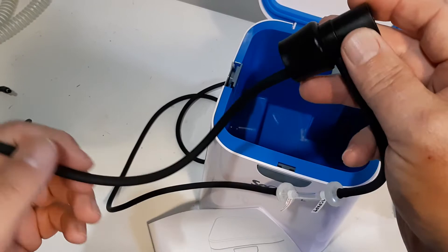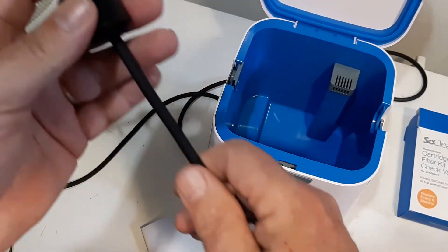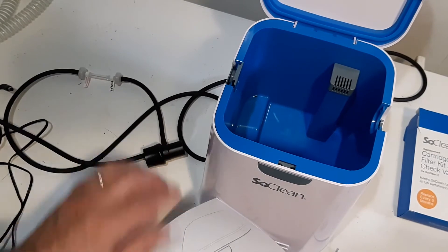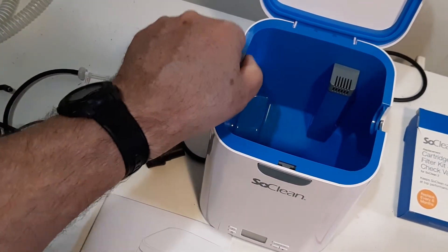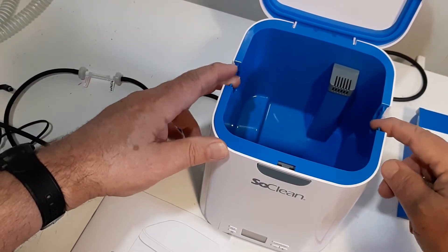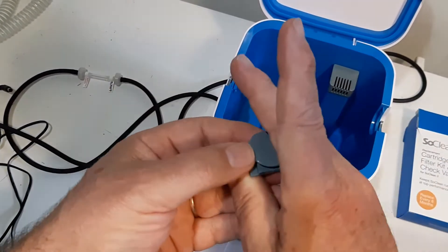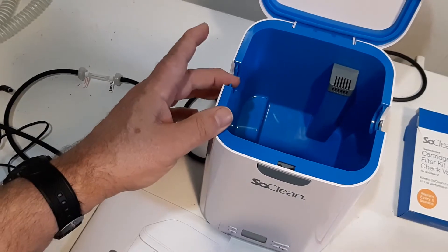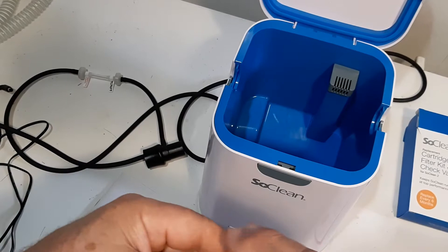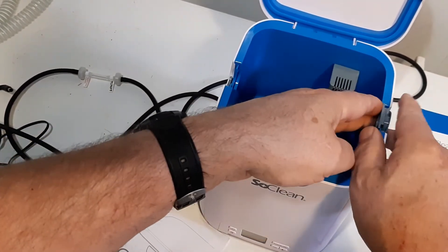Now, this hose is going to be cut a little bit because it's too long. It's a standard hose length, and depending on your mask and where you hold your distilled water, you'll have to cut it back. The unit has this plug here, and there are two interlocks. The machine will not turn on if these two interlocks are not met. This plug can go on either side depending on which side you have your mask on — you can have it reversed, whatever you want.